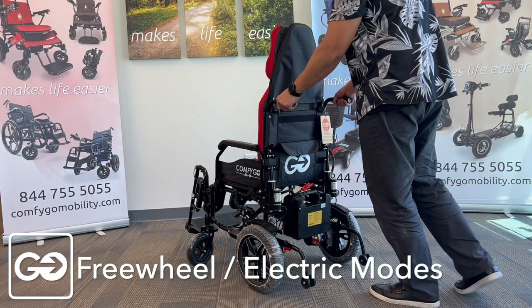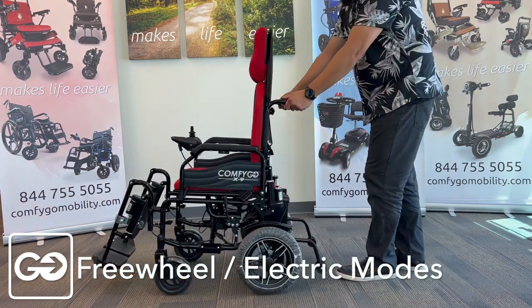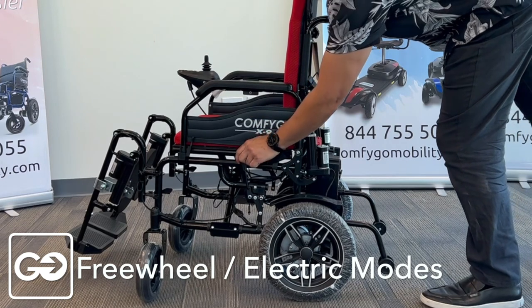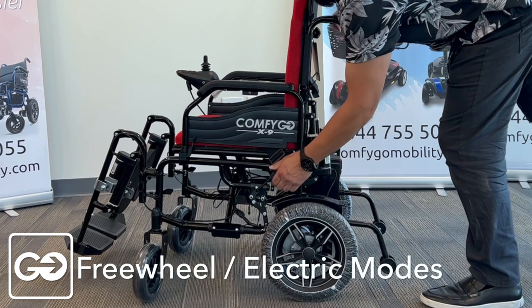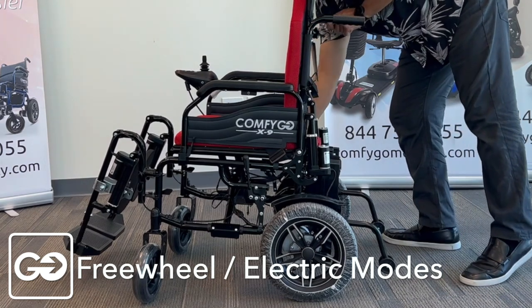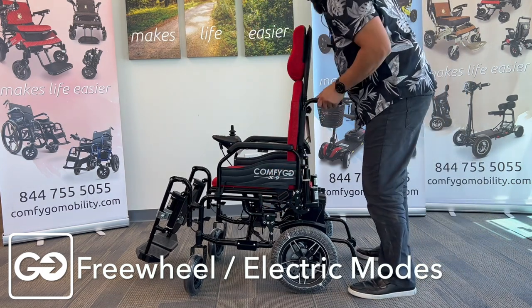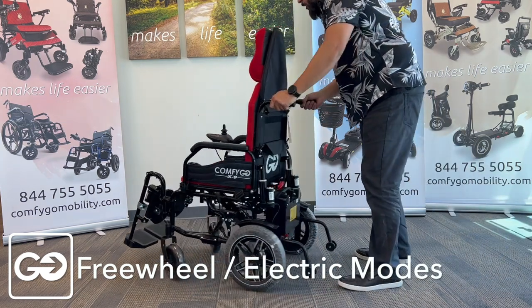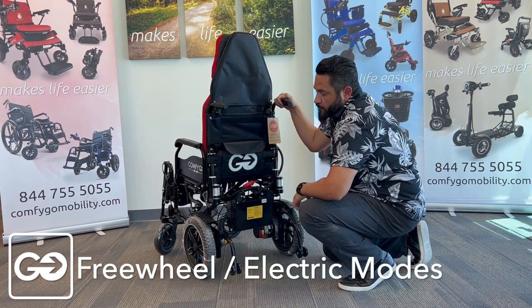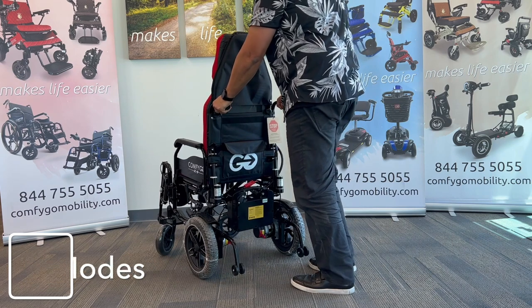With your chair in free wheel mode, it's very easy for a caregiver to push this chair back and forth — the wheels are free and we can move it in all directions. While it's in free wheel mode, the important thing to notice is that there is no braking system, so we do have manual brakes here. Make sure these are engaged anytime you are setting somewhere on a hill or slope — engage the brakes on both left and right sides, as this will stop the chair from moving. When we change this over to the lock position, we have an electromagnetic brake that keeps our chair from moving, so a caregiver can't push it and it will not move unless we have the controller activated.